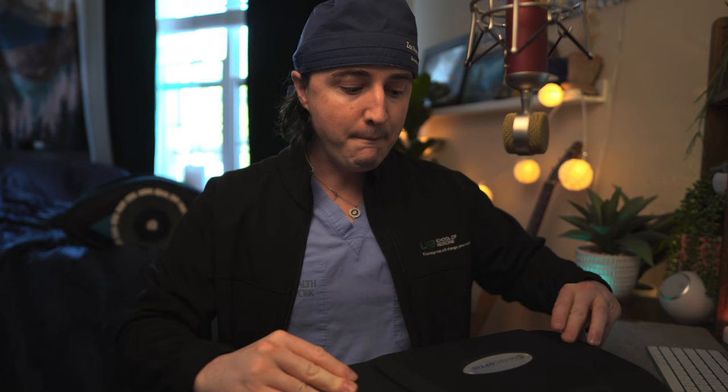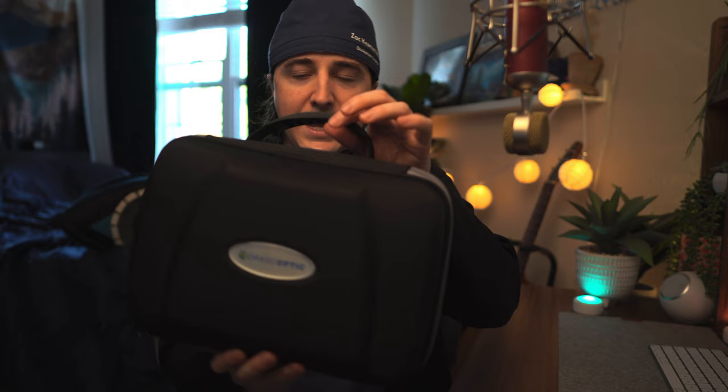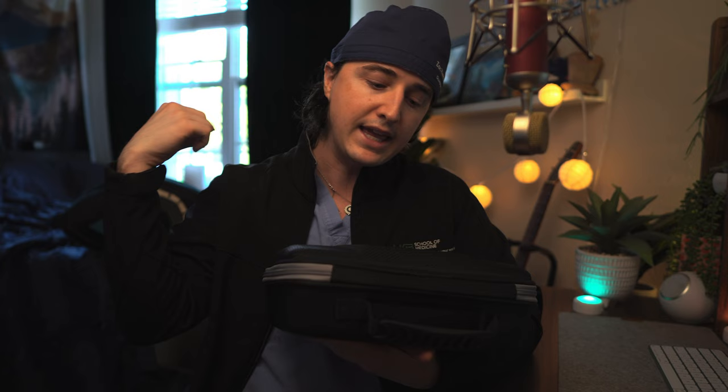Let's open it up. Their case is super nice — very nice material, very hard. It has a handle. The only thing I'd like to see is attachment points for a shoulder strap. Because it doesn't have that, I actually end up not using my Oroscoptic case and instead use a little Sony camera bag to hold my loops. But the case itself is really nice — I just want to see the ability to add a shoulder strap.